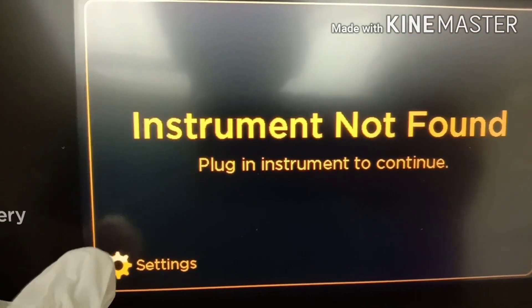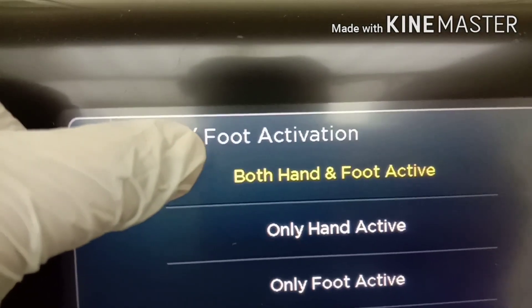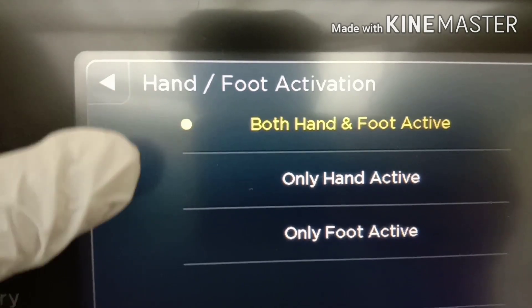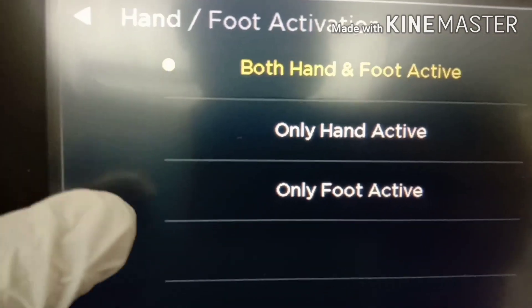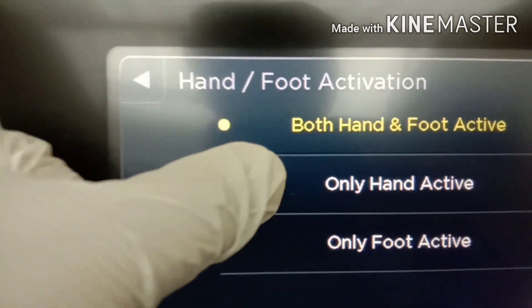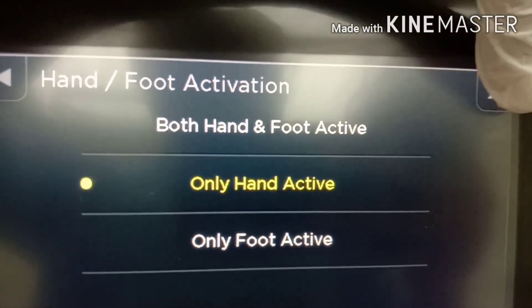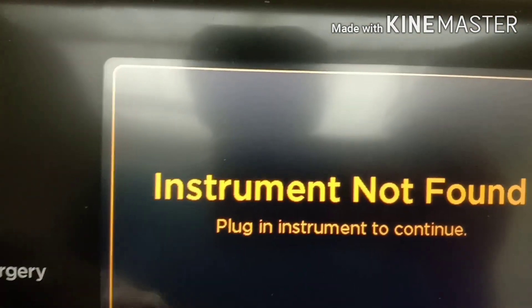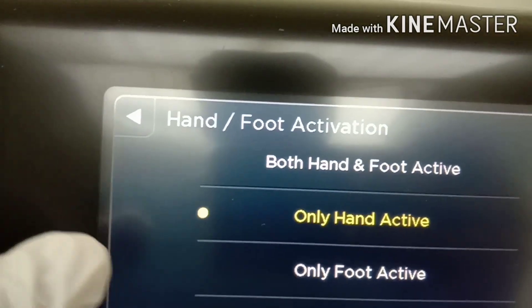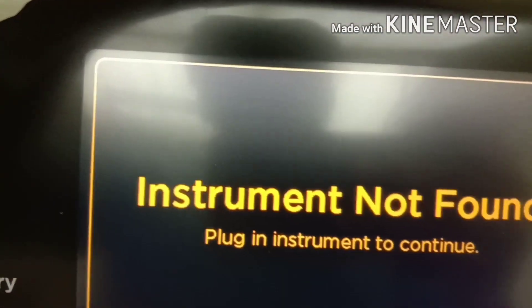Go to settings and here you can see hand activation or foot activation. You can select both hand and foot activation, or only hand activation, or only foot activation. If the surgeon wants hand activation, click only hand activation and close the window. If the surgeon wants foot activation, select only foot activation and close the window.